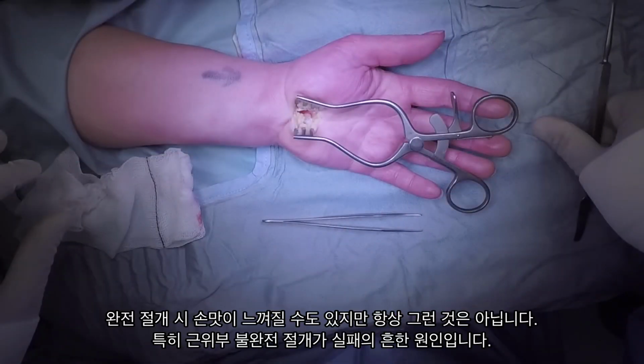We don't always get this tactile feedback, and often we can't see the limits proximally and distally of the ligament to be able to confirm visually that it has been fully released. One of the commonest reasons for failure of this procedure is incomplete release proximally, where the flexor retinaculum becomes the antebrachial fascia. So we need to make sure that we've completely divided the ligament before closing.